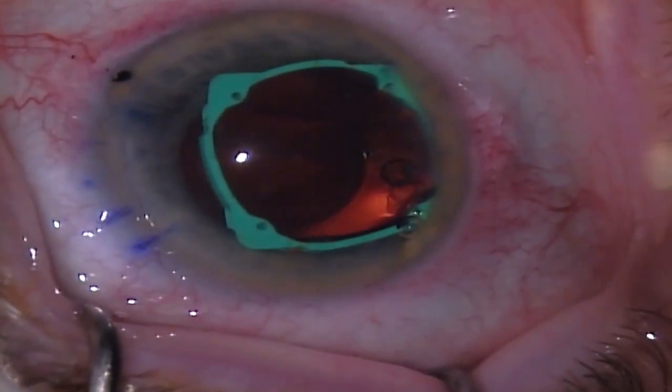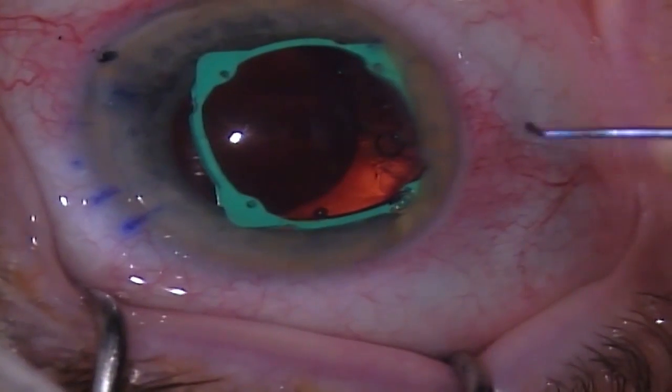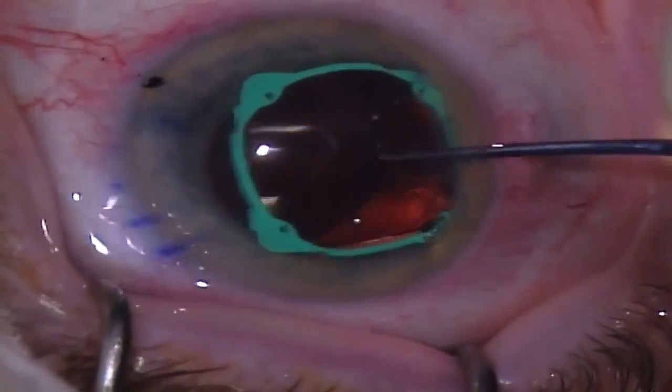In this case, this is a Star NanoFlex intraocular lens. Once again, the low profile of the eye ring does not interfere with lens placement.